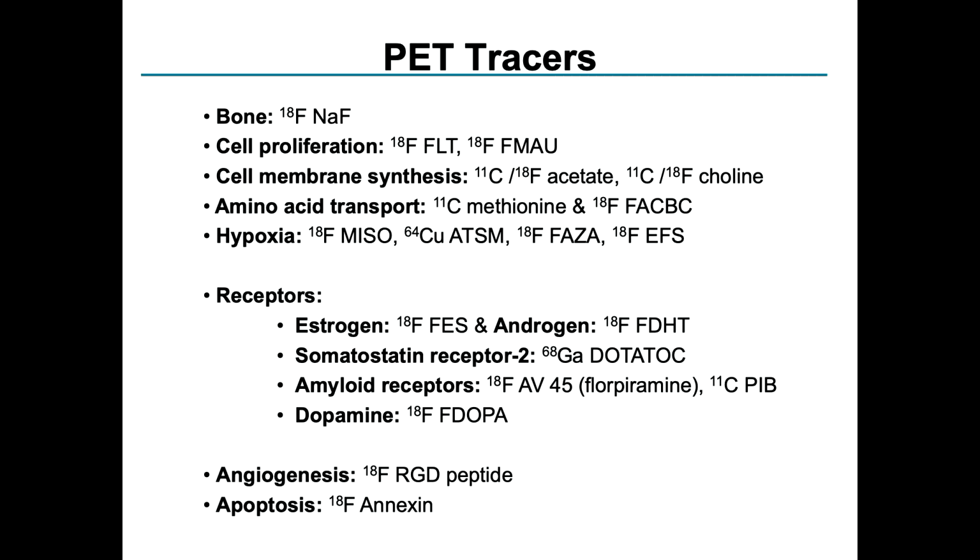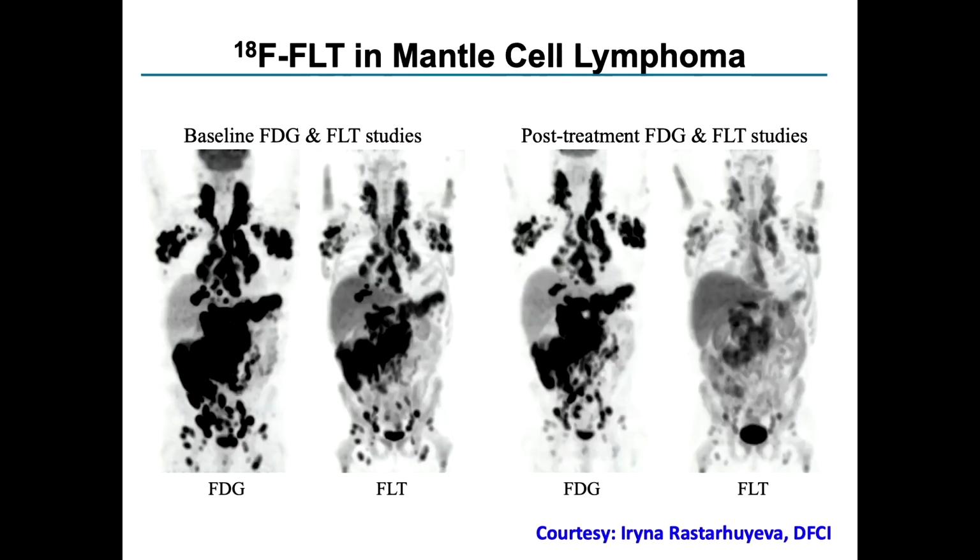All right, so whenever I think about oncologic PET, I think about all the radiopharmaceuticals we have available to us. Now, I must admit, in this particular talk, I am going to stick primarily to FDG, but let me mention a few and let me discuss why. Whatever you do, and it's becoming more and more important nowadays, you want to think about, at the end of the day, why is the patient being referred to you, and what does the clinician actually want to know? And therefore, what might be the best radiopharmaceutical to use?